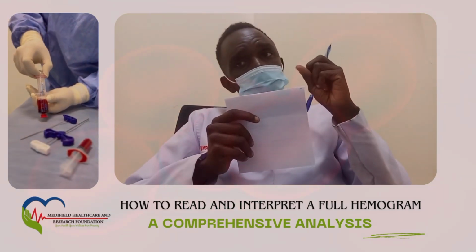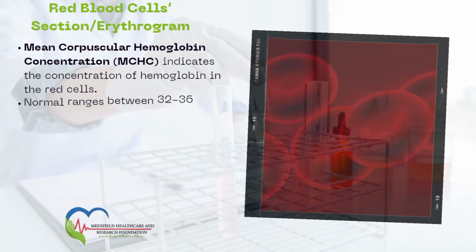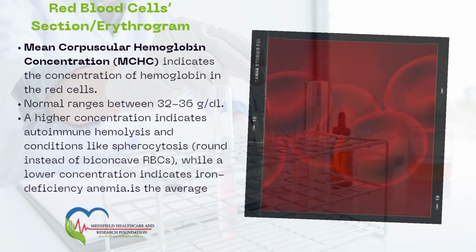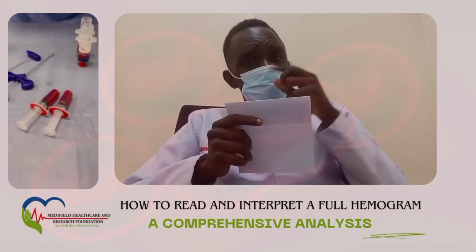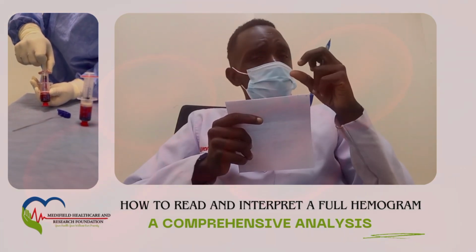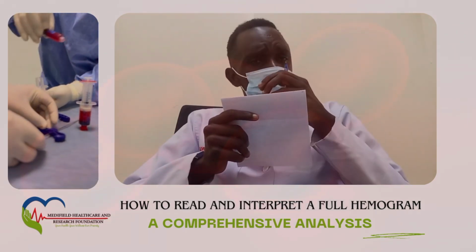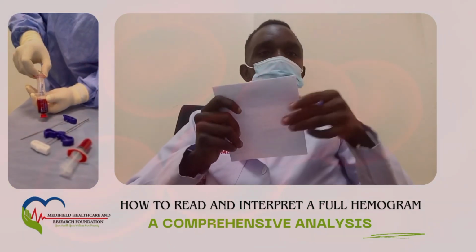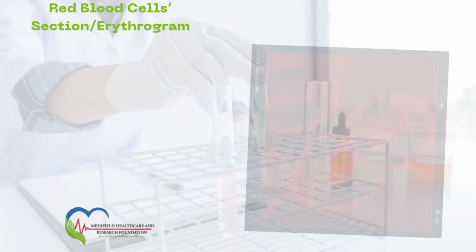And then the other part, of course, is the mean corpuscular hemoglobin concentration, which is a red blood cell index that indicates the concentration of hemoglobin in red blood cells. So this is just MCH addressed as a percentage of the entire hematocrit. So it is calculated from MCH. So MCH divided, of course, by hematocrit times 100. That percentage is what we call the mean corpuscular hemoglobin concentration.